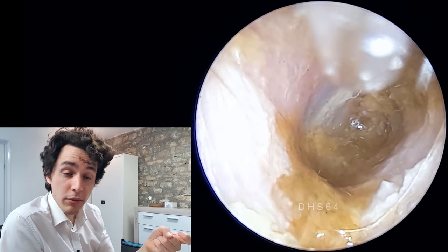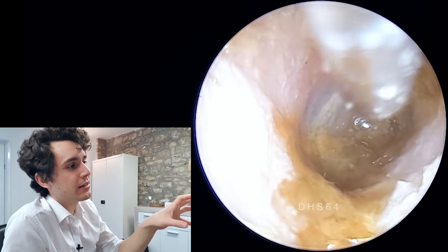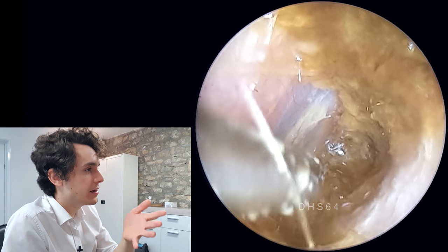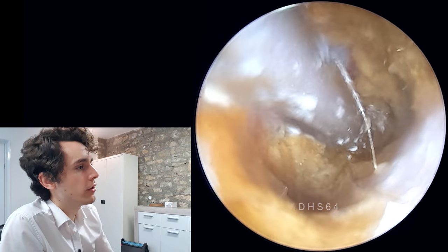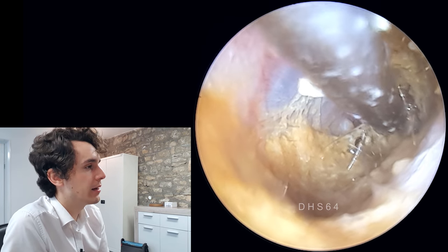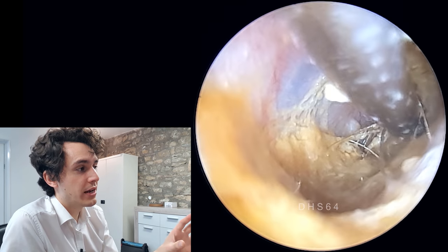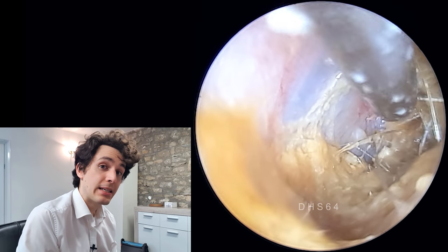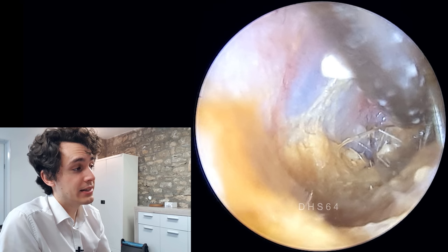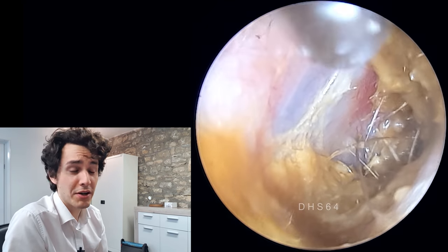In this case I decided to use a manual irrigator. And you can see the ear is looking significantly cleaner — it's cleared away all the slime that was on the left-hand side. Now we've got the remaining ultra-sticky adhered wax deeper in the ear canal. For safety reasons I decided to go with irrigation, but we also have the added benefit that the water will hopefully loosen up some of this wax and dead skin and make it a little bit softer, giving me more purchase to try and remove it.